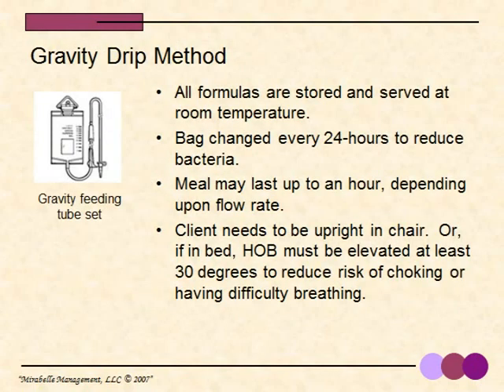All formulas are stored and served at room temperature. The bag must be changed every 24 hours to reduce the rate of bacteria. A meal may last up to an hour depending on the flow rate. It is important to have the client sit upright in a chair, or if in bed, the head of the bed must be elevated at least 30 degrees to reduce the risk of choking or having difficulty breathing.